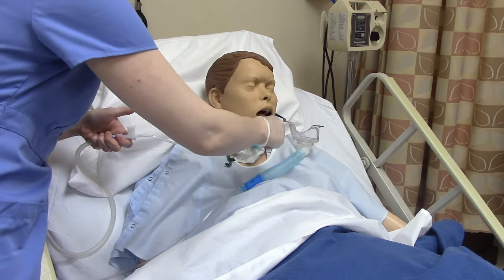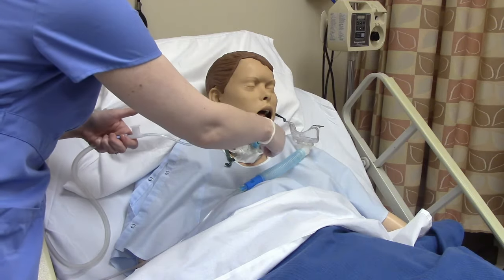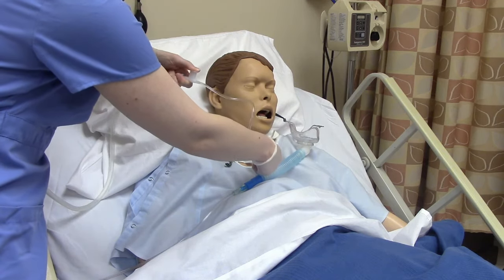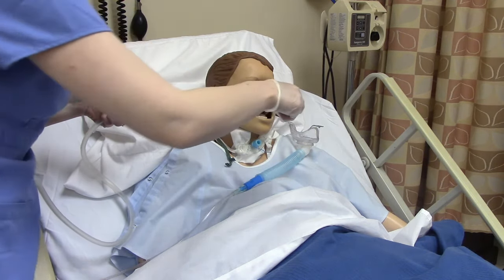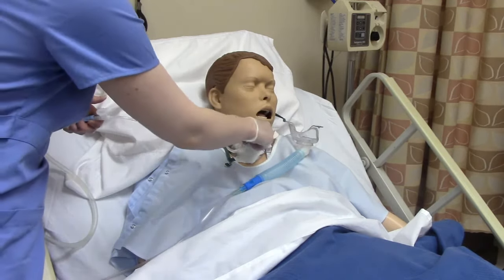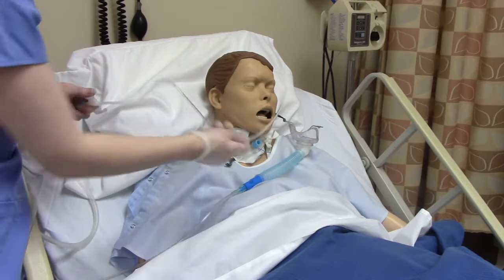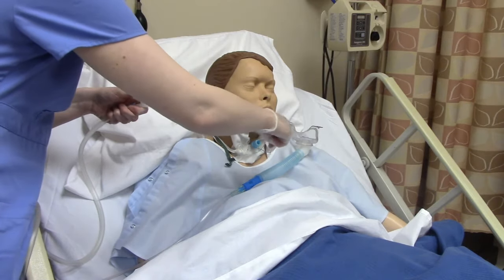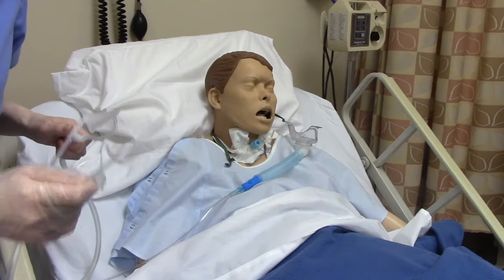Insert the catheter until the patient starts to cough — that's how you know you're in the right spot. Then take your non-dominant hand, apply your thumb to the port, and remove using a little wrist motion rather than pulling it straight out. If you pull it straight out, you risk hitting the gown, hitting the trach collar, making a mess, and breaking sterility. That wiggle wrist motion ensures you don't accidentally contaminate anything.